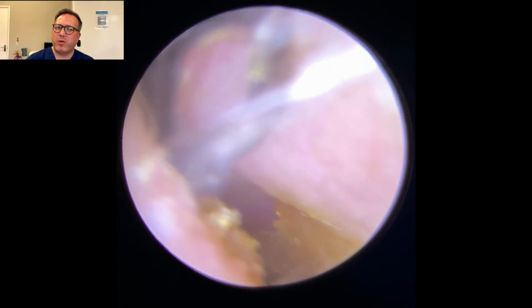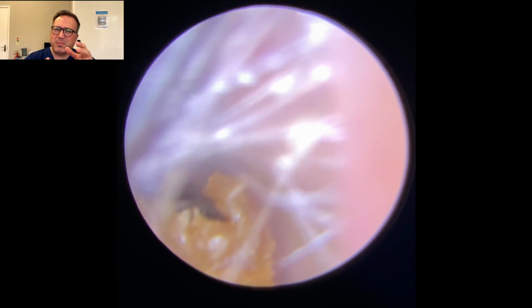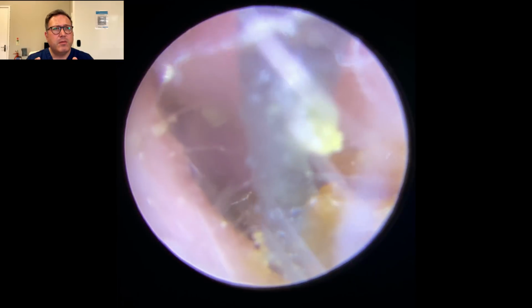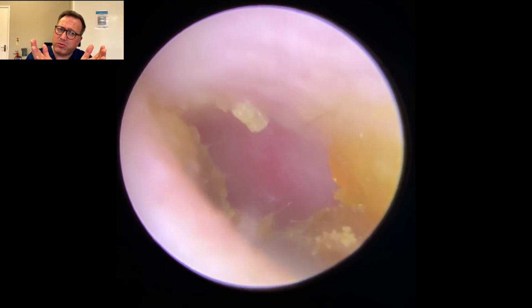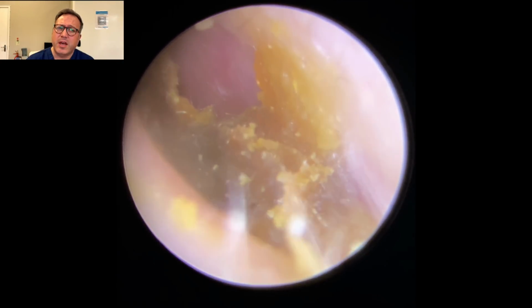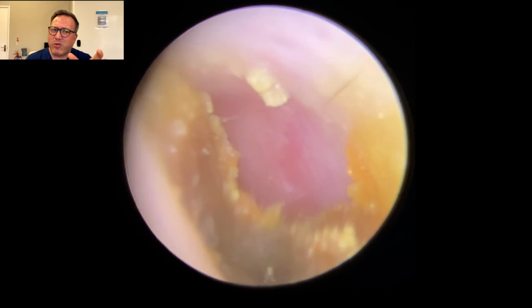It becomes more problematic the more you scrape away the top layer of wax, if you like, because it becomes a much more awkward shape to work with. If you've taken the central section away, it means you've got to work closer to those canal walls on both sides. You can see the dryness in there, how it's really almost bordering on a little bit crumbly in places.